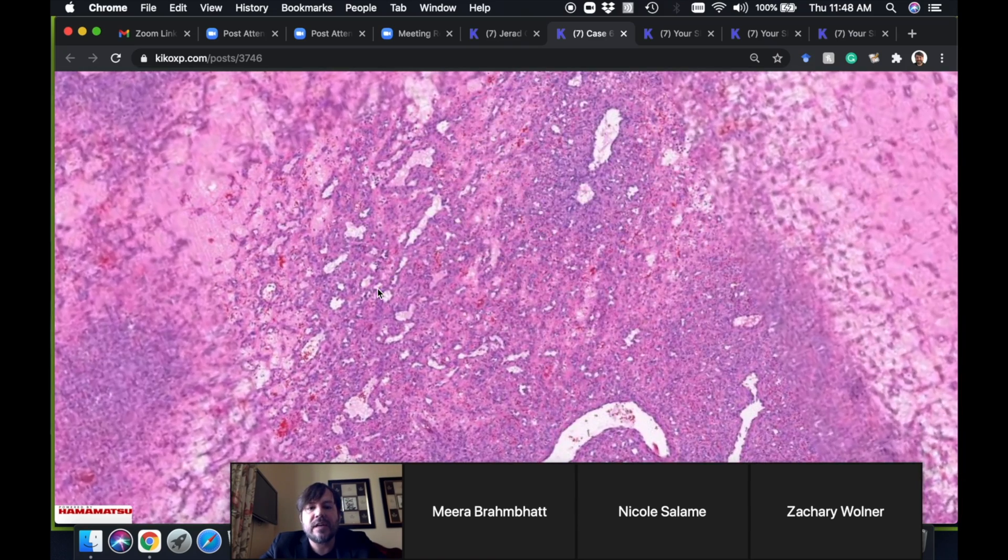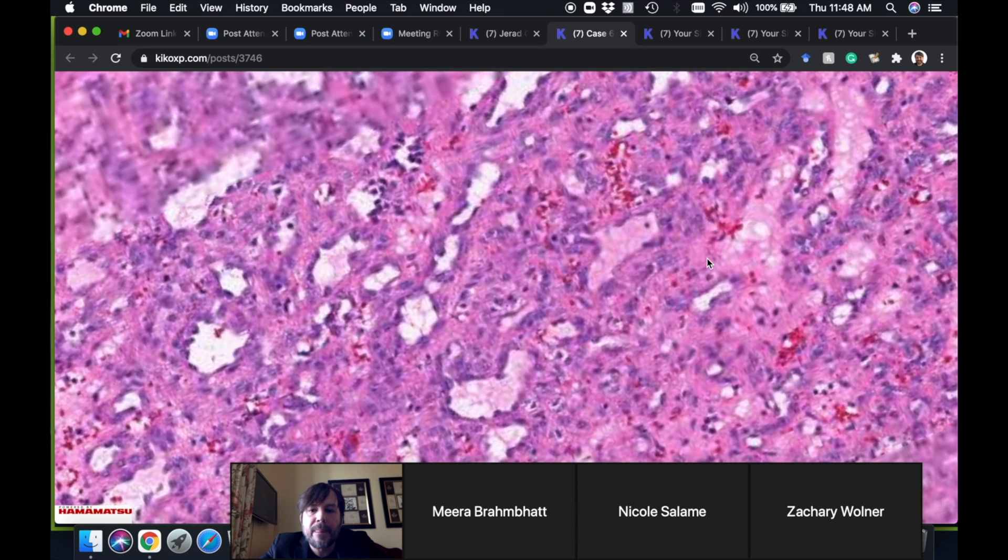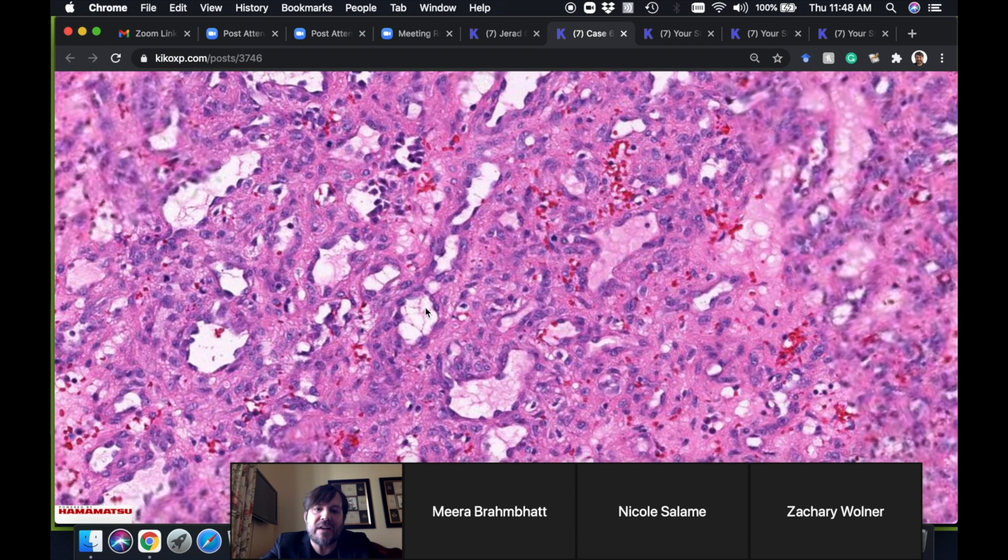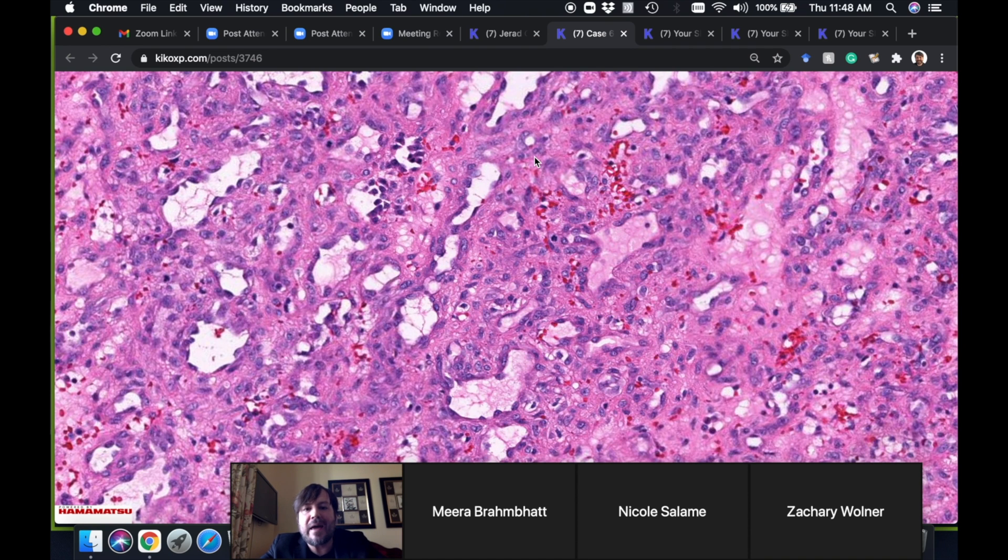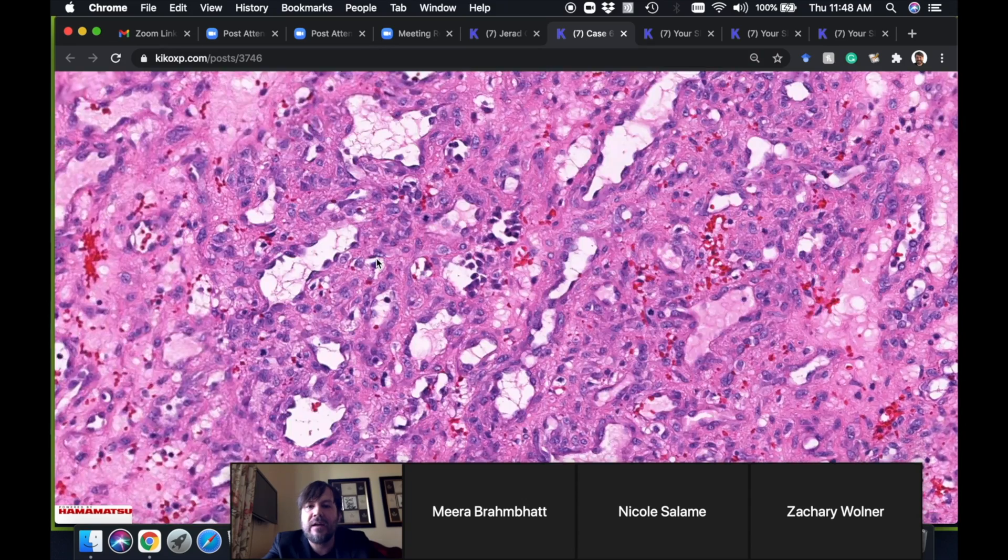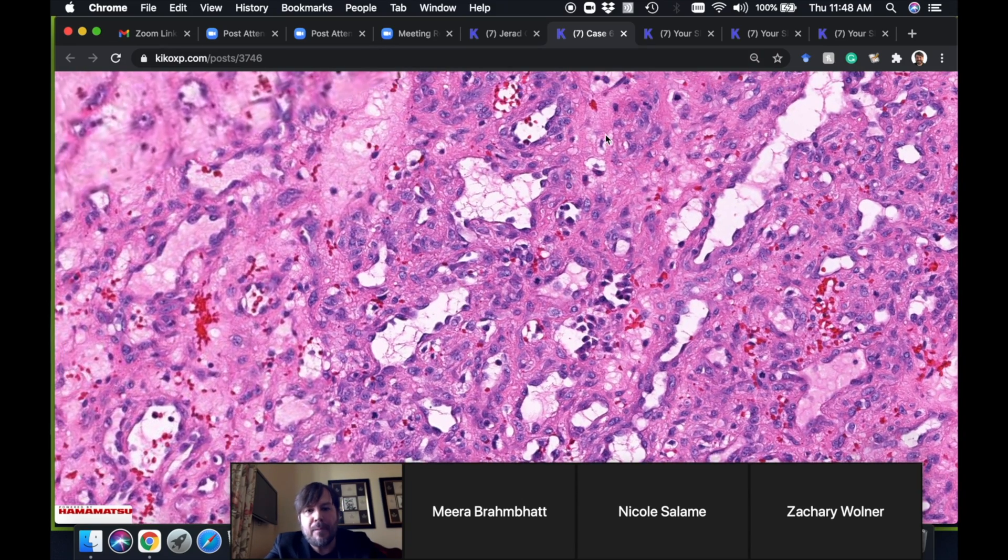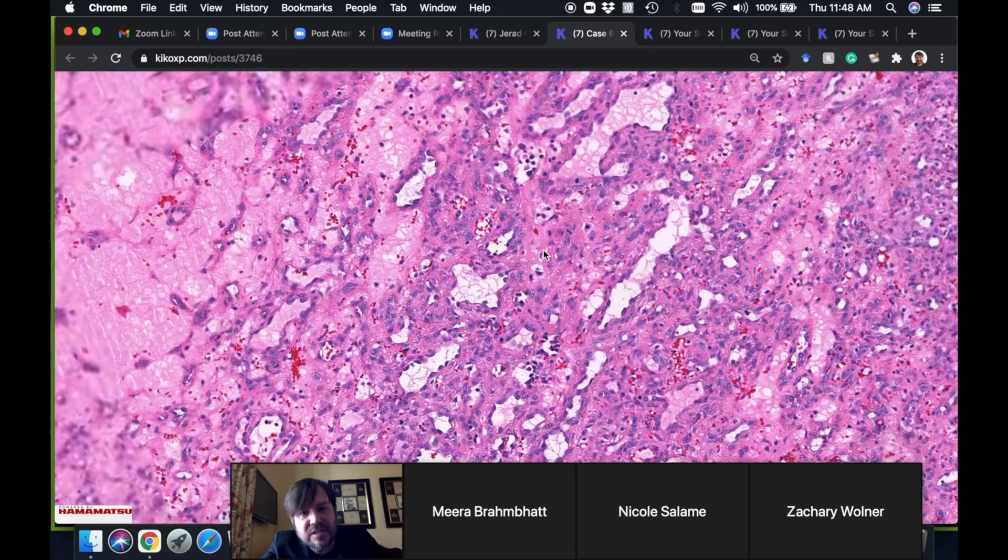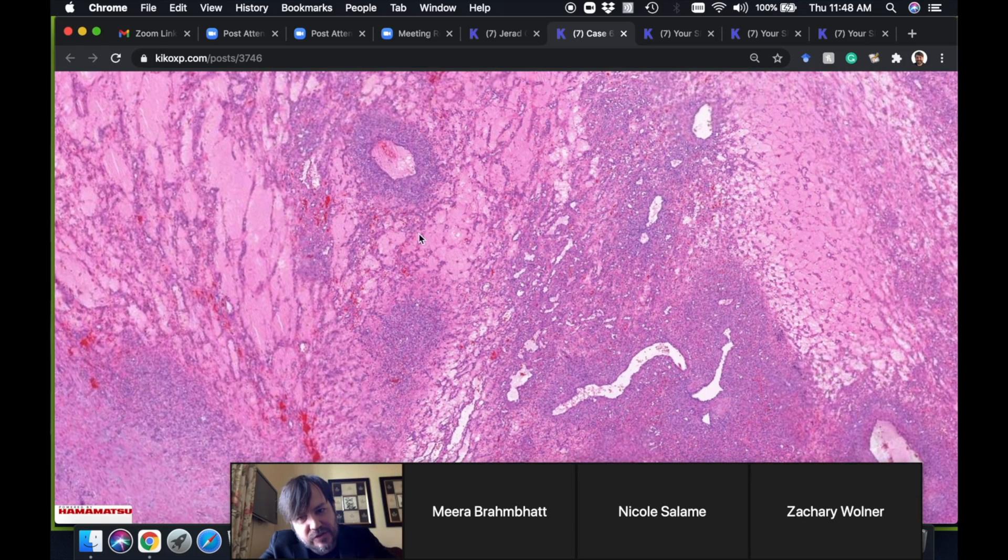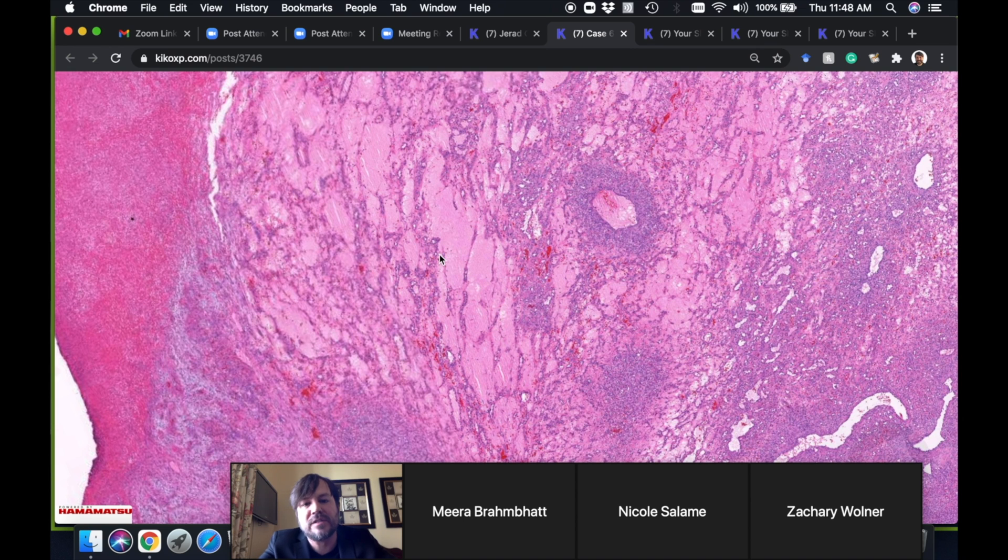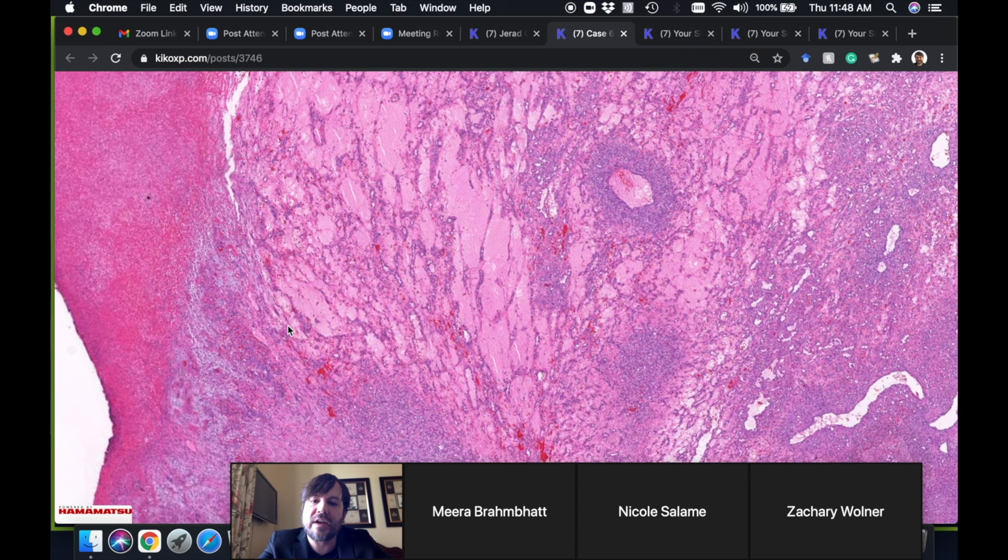Enough from low power, but the low power really helps with these things. Let's go in closer and take a look. What we see here are small vessels with plump endothelial cells around them. There's a lot of cells in between the vessels—many of these are going to be pericytes, which are actin-positive modified smooth muscle cells that wrap around small vessels. There can be variable amounts of hemorrhage and inflammation, although the inflammation tends to be more prominent near the ulcerated surface.